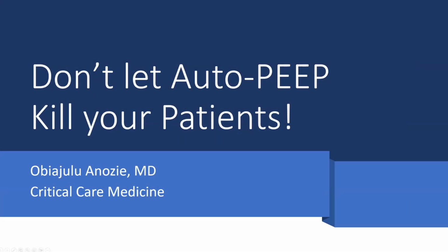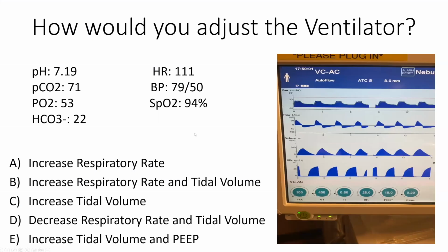I'm going to talk about AutoPEEP today and some of the detrimental effects and how it can be detrimental for your patients that are mechanically ventilated. And to get this started, first I will show a little bit of a ventilator waveform.